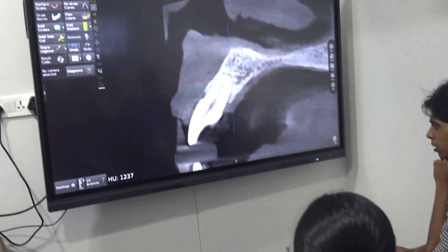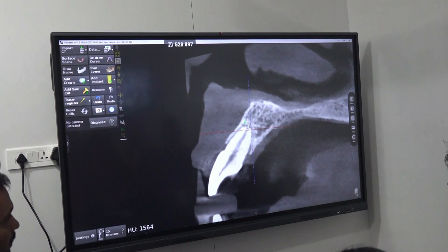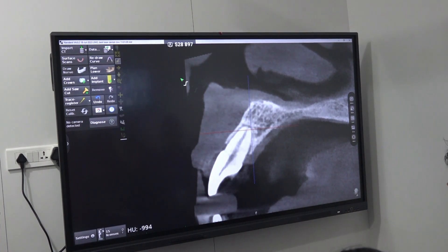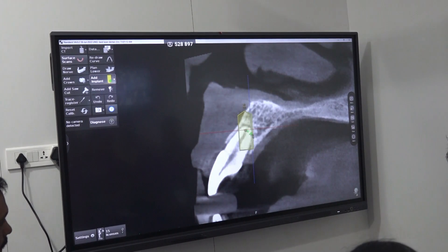The labial plate is good, so I can place an implant virtually. I will now place an implant virtually.